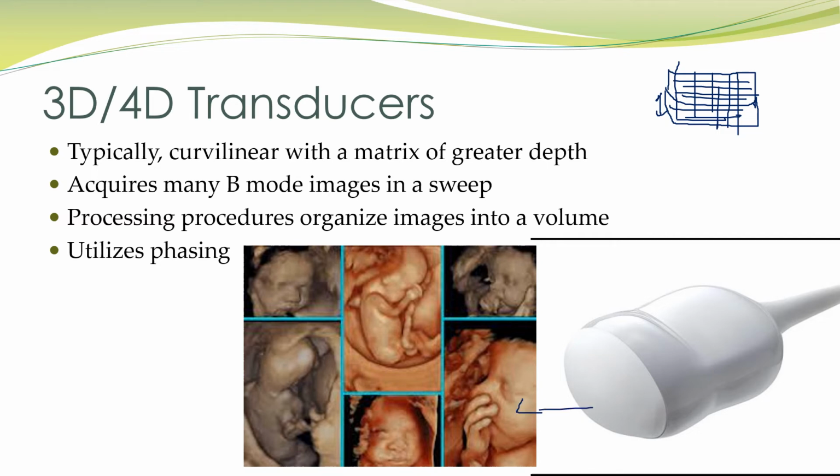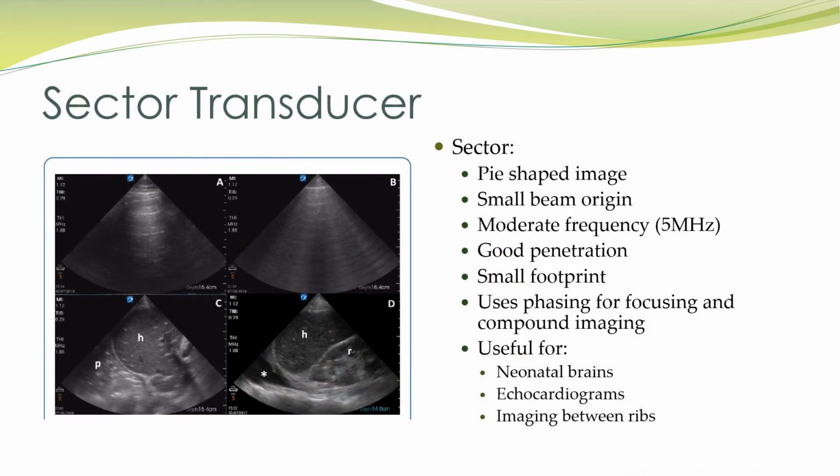These work nicely. I think we talked about before, when you're trying to see the endometrial volume of a uterus or identify if an IUD is within the uterus, things like that. It works really well. Also great for bonding for parents. But once you're used to scanning in 2D, it's not going to provide you that much more information than you would otherwise have from your regular scans.